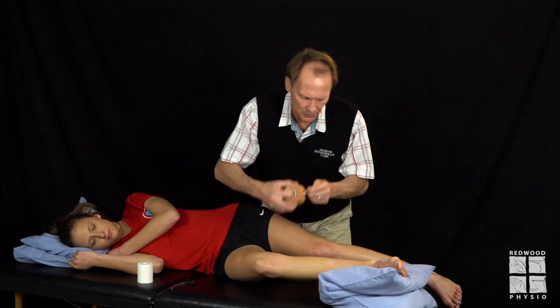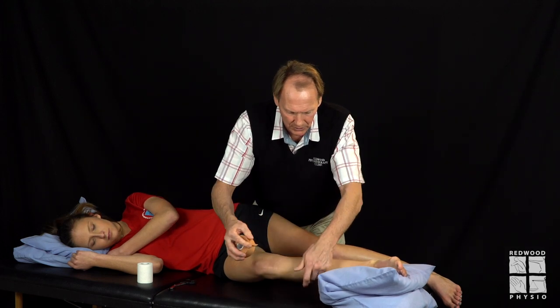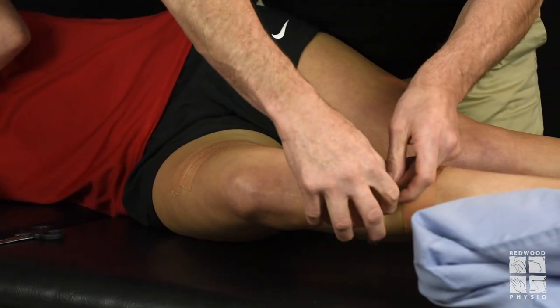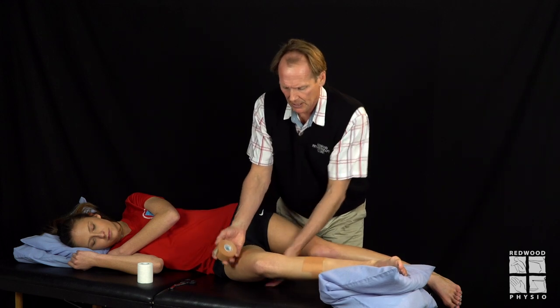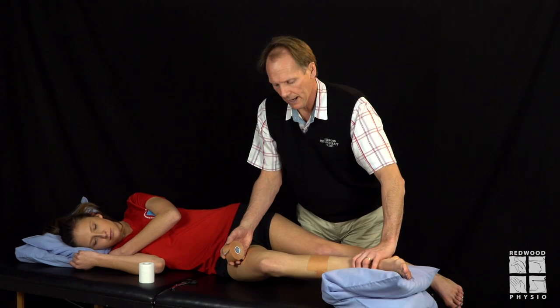How high up you go depends on the size of the person to a large extent, and how many fixes you apply also depends on the size of the person. If you've got a very large athlete then you're going to use more tape and more fixes. In Christie's case here, for purposes of demonstration, I'm not going to get excessive with those fixes.